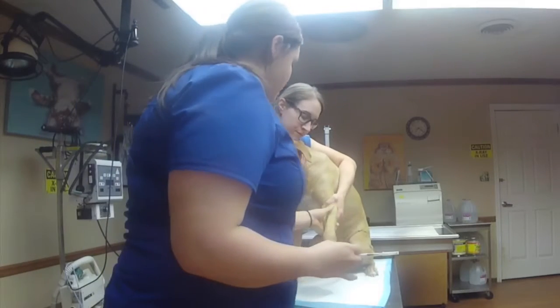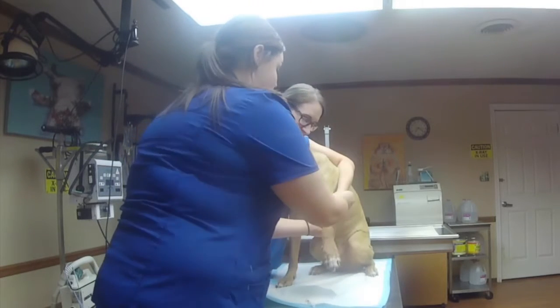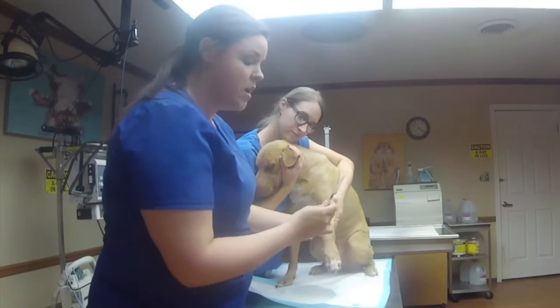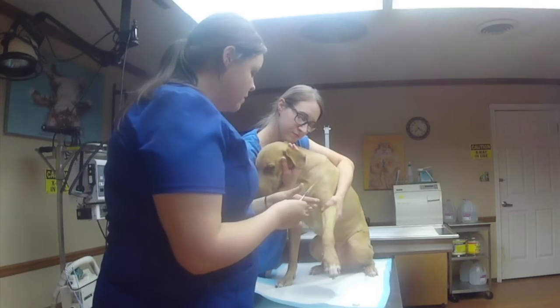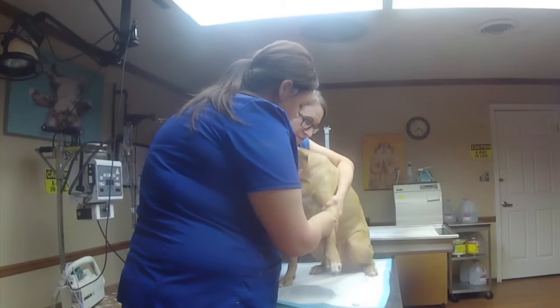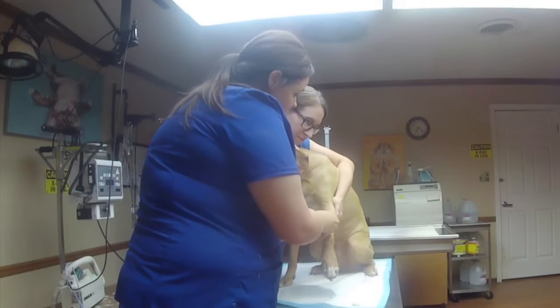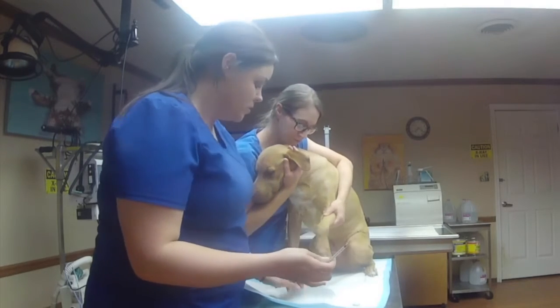This is how you inject intravenous. Okay. So I just have saline solution in my syringe. What you're going to want to do is insert the needle with the bevel up. You're going to want to insert and then pull back on your syringe to make sure you know you're in, and then have the person let up and just inject slowly and apply a little pressure so he doesn't bleed.